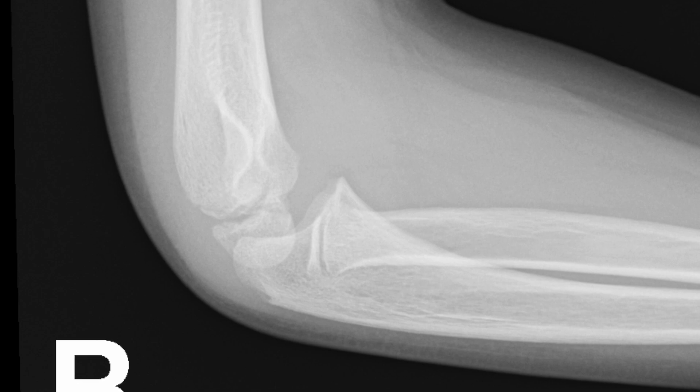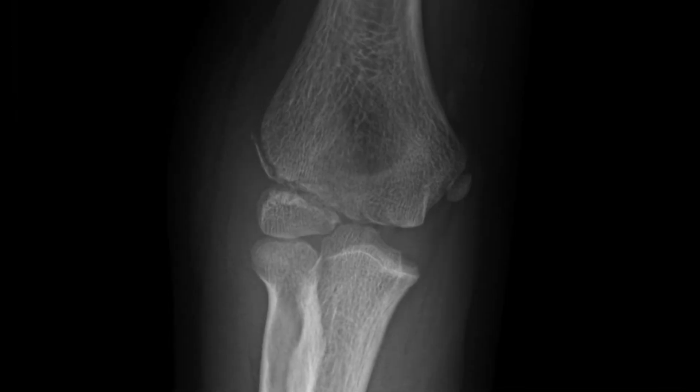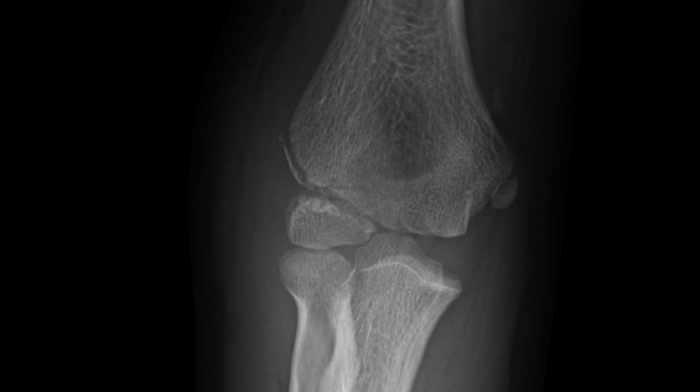The fracture is not visible on the lateral view, but can be seen clearly on the AP and the multiple oblique views that were obtained.